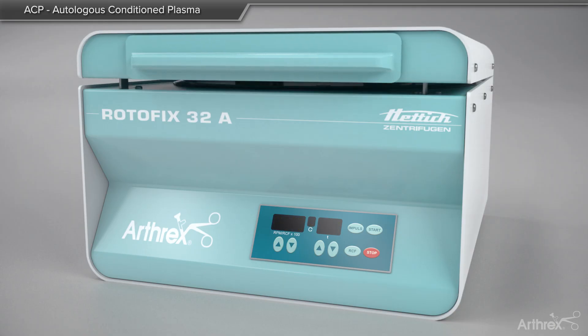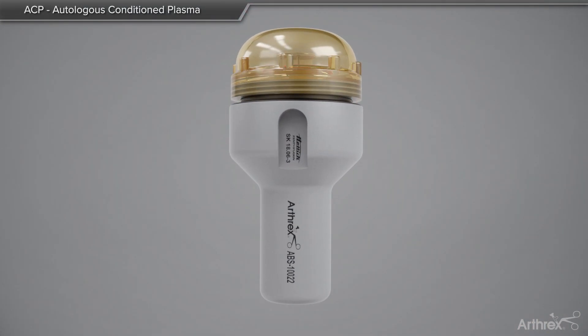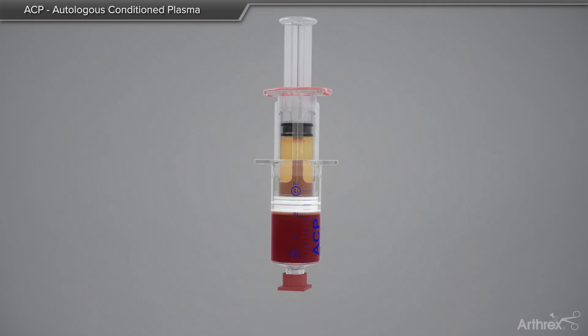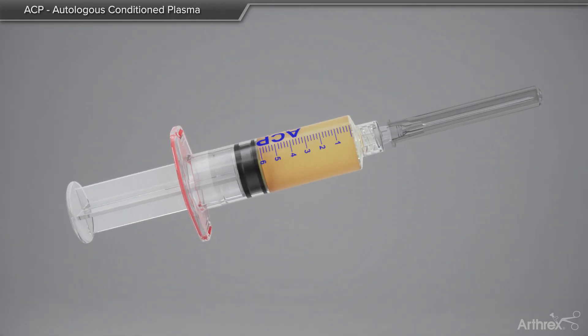Once the centrifugation is complete, the double syringe is removed from the bucket, taking care not to tip or agitate the separated layers. The yellow plasma layer is then removed by gently pushing down on the outer portion of the syringe while pulling back on the innermost plunger. The inner syringe is then twisted in a counterclockwise direction and removed. A needle or cap is placed on the syringe for use at the point of care.